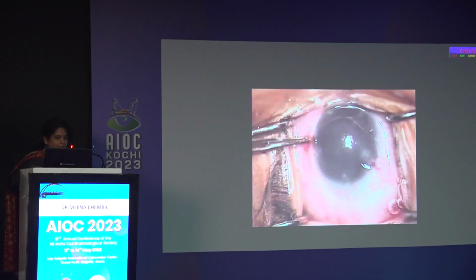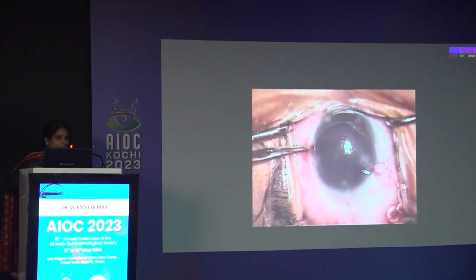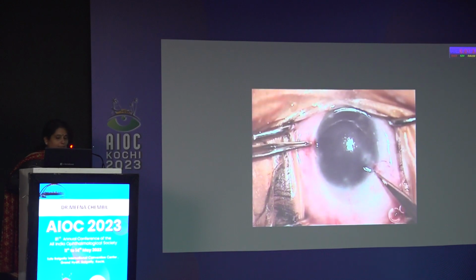So this is the first case actually. This child, whenever you manipulate the iris of these children, the next day it will be okay. Even for 2 weeks, the first follow-up also, it might be okay, but they might come back with occlusio pupillae. That is one problem. There can be severe reaction in these children, and usually we tell them, if you have any problem, any discoloration of the cornea, or you feel anything different in the child, immediately bring the child.